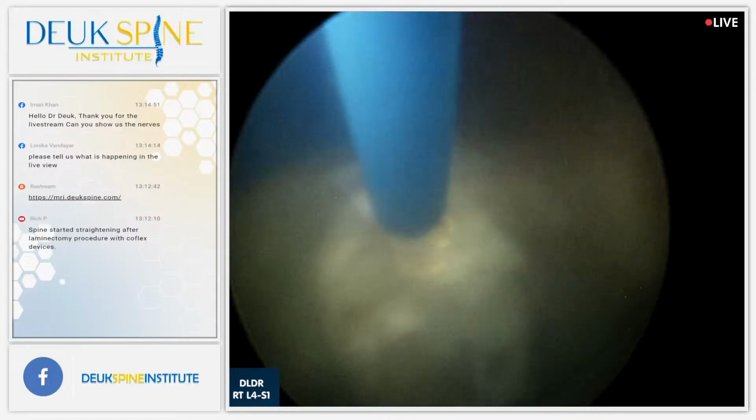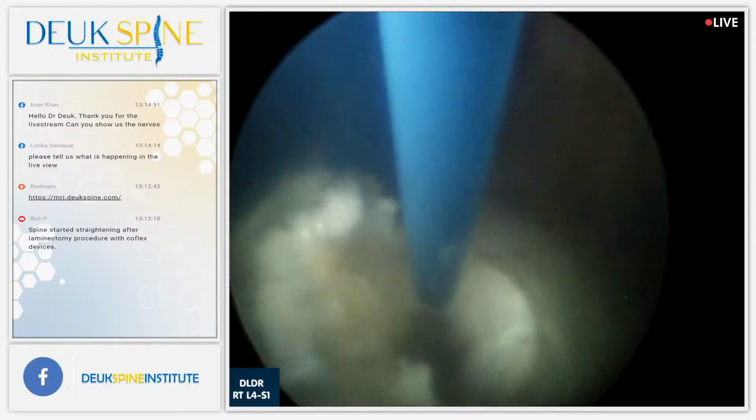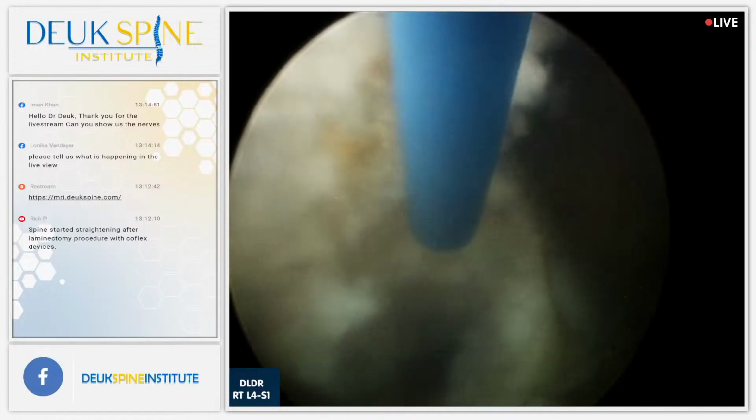All right, you guys saw that pink tissue I just zapped away there, Henry? That was the inflammatory tissue. Have you run the video on how the Deuk laser disc repair works? Not yet. Let's do that so you can see. Copy that.